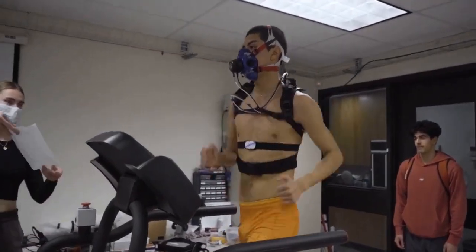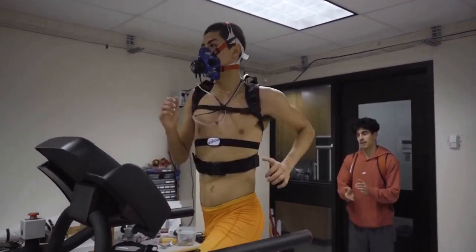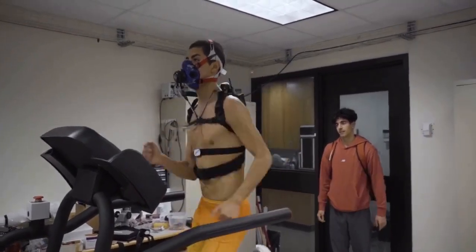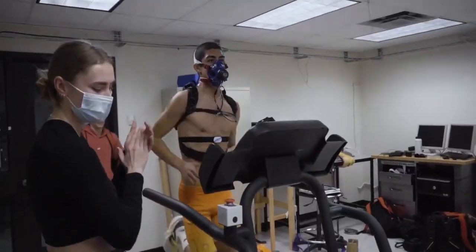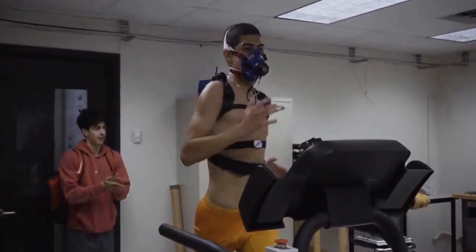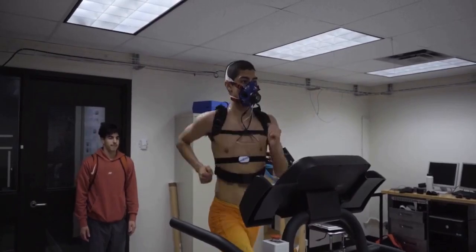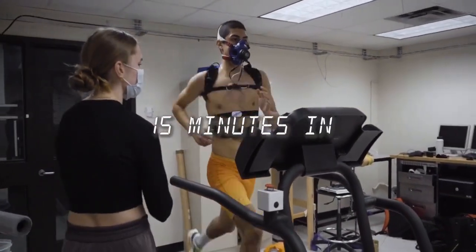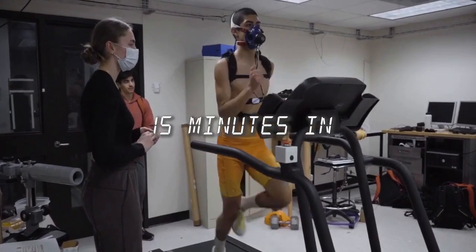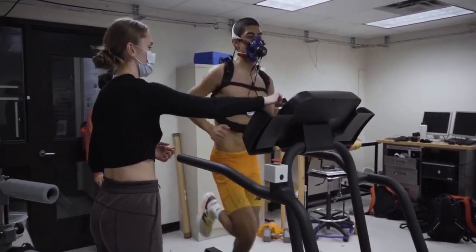Keep your form, 20 seconds left. Let's go, Jose — you got at least two more minutes. Push it to the end. You've got 10 seconds, you can do it. Come on Jose, keep pushing. Let's go, keep it up, keep your form, stay strong. 5% incline, 20 seconds — is that okay? No? Okay, we're calling it. Keep going, you got it. Less than 20 seconds left. 10 seconds left, let's go. 5 seconds Jose — 2, 1, and done.